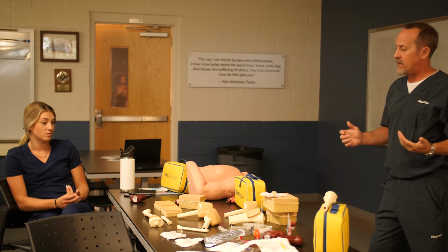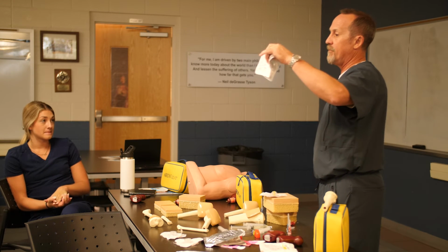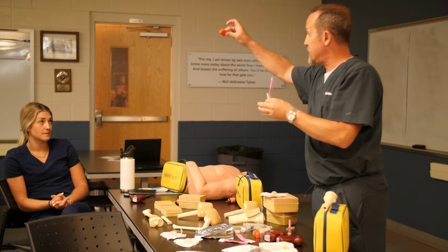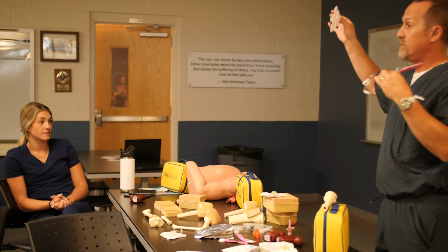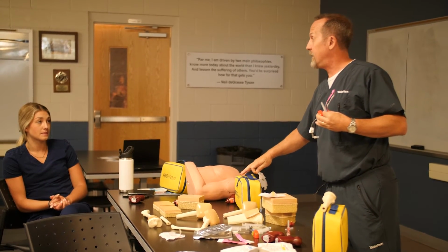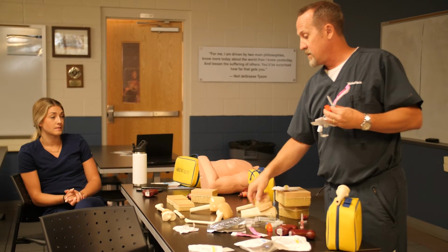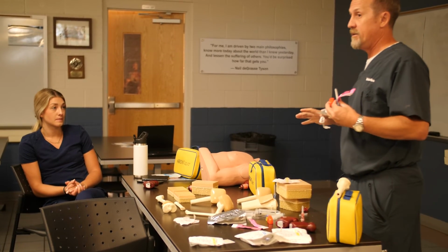So just one thing I want to touch base on, you guys have these yellow kits. The way that you get your packs, it's going to be a peel pack that has your needle set. It's going to have your little pink bracelet, your sharps, and an extension set, okay? And then you'll have a separate kit that has your stabilizer dressing in. Hopefully, and I think you do, have everything that you need in this bag. The additional items you're going to need are some sort of skin prep and your sterile saline flushes, okay? So if you have that stuff all in that bag, if you need to place an IO, you grab that yellow bag, you should have everything that you need, okay?